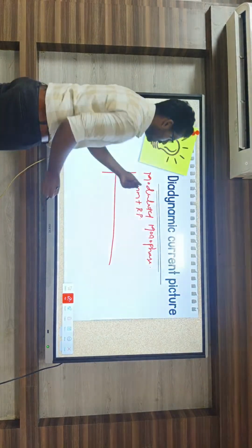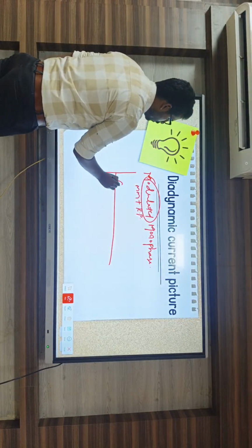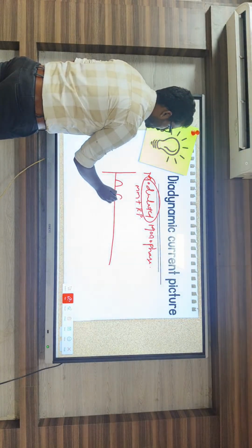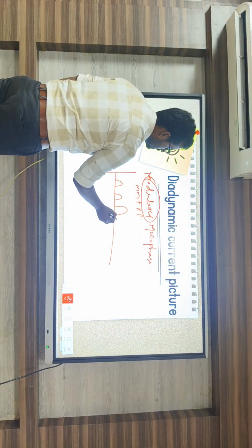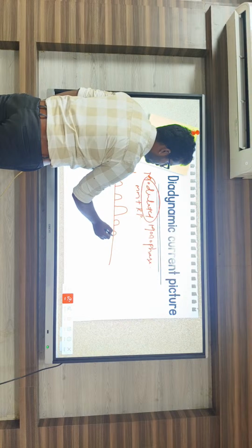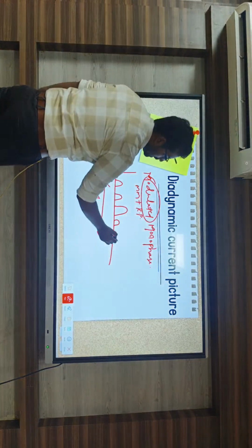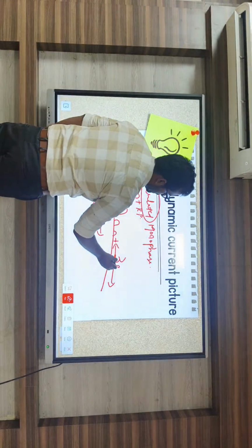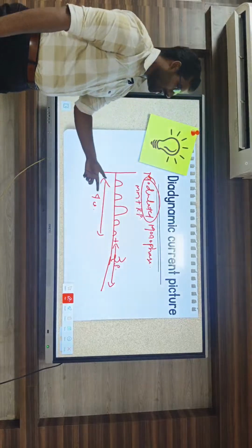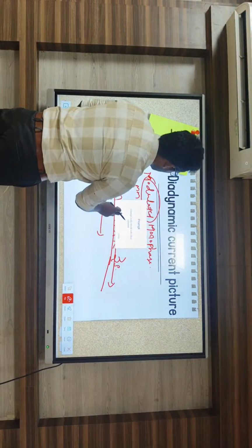The name itself means the frequencies are modulated. So what about the monophase? This is the single phase, followed by the resting period. The frequencies are going to be altered. This is 4 seconds plus resting periods of 3 seconds.